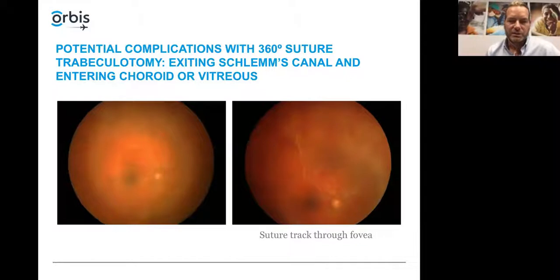One, I didn't monitor with gonioscopy while I did it, and also I was attempting this early in my career on someone who had had angle surgery before, so I think there were some obstructions. But what you see in these photographs is that the one on the left side of the screen is before the procedure. It's taken during the EUA, preceding the procedure.